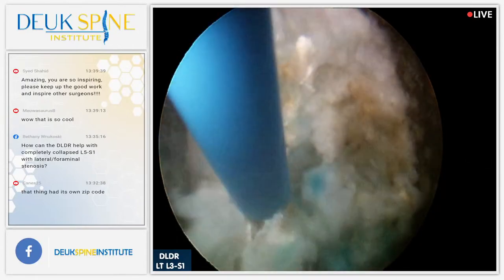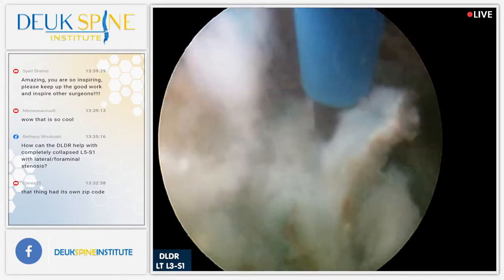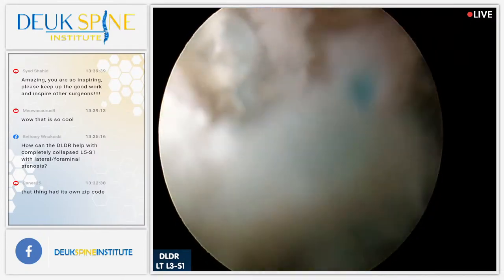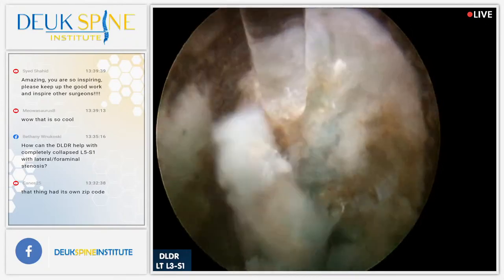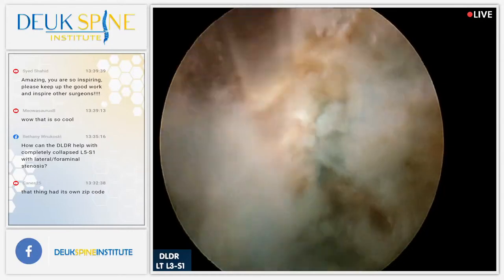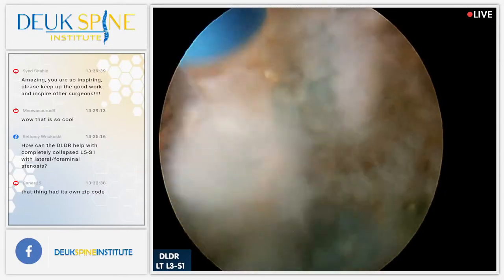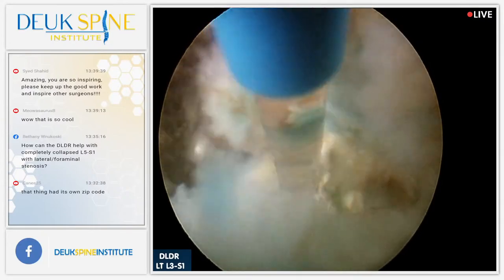See the annular tear right there? That blue tear. We just passed it, but I'll come back to it in a moment. How's he doing? Are you happy with his level of sedation? I am. Can you make him lighter? If lighter is better for you, then do it.